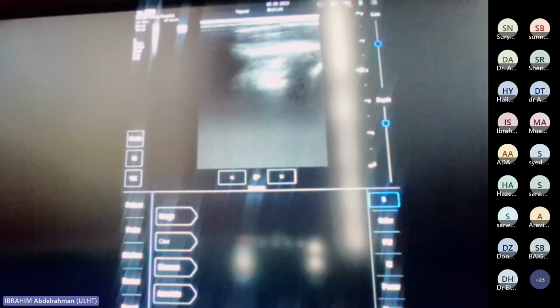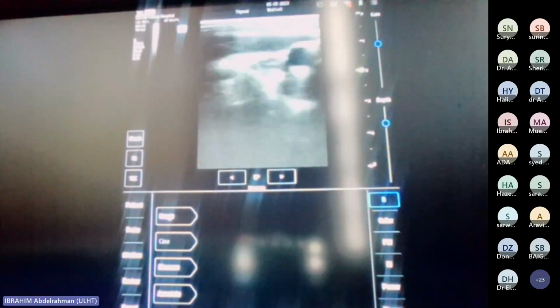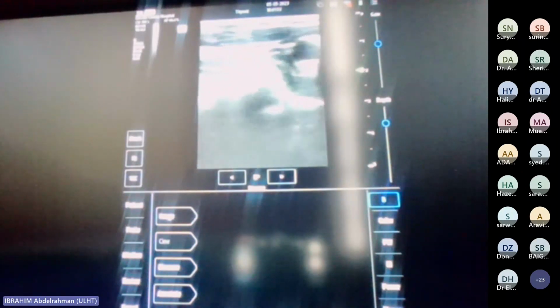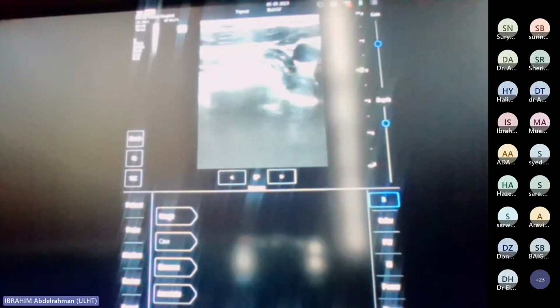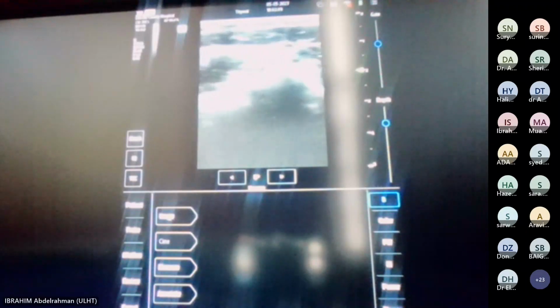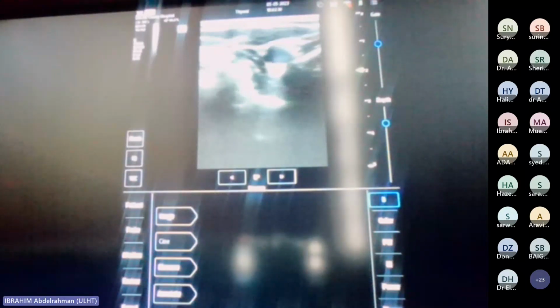So say we are marking, we haven't got any lymph nodes in the neck, say we're marking this area. So you're marking that area there. I would bring it to the edge of my probe here. Or you can bring it to the middle and mark there, but you're going to be a little bit higher. Exactly. So what I would do is get into the middle of where I'm trying to mark, and then bring it to the edge of my probe, which is here. And you can just, oh, I'm scanning the wrong way.